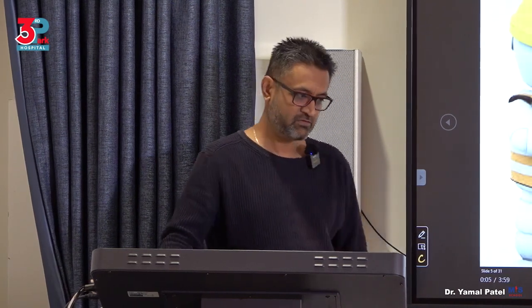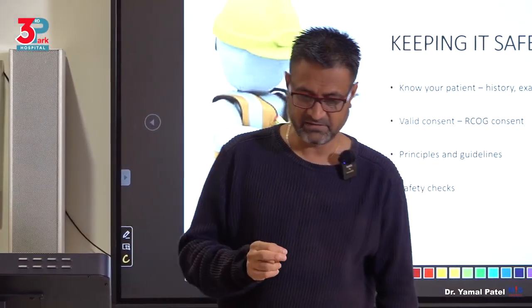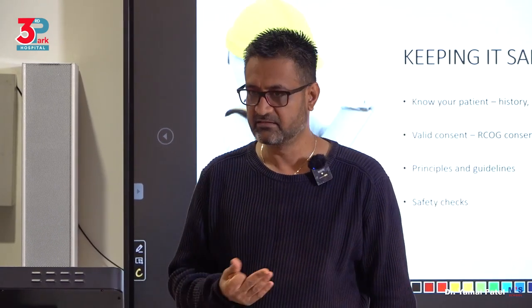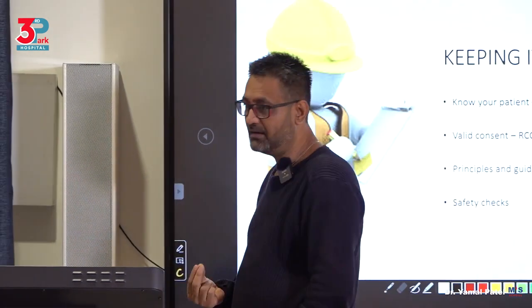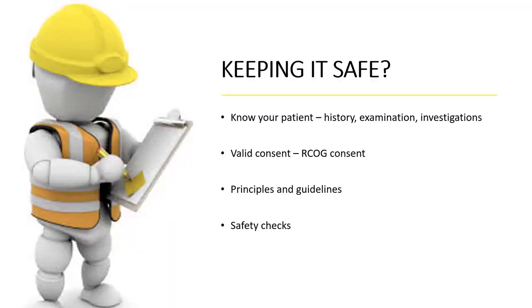I told you hysteroscopy might be a short procedure. Frankly, most hysteroscopies take me less than 10 minutes, okay? And most diagnostic hysteroscopies take me 2 minutes, okay? So it's a very short procedure, but I told you it can be very dangerous as well. So how do we keep it safe? We keep it safe by making sure we know our patient well, both in the history, examination, investigation, everything is clear. We keep it safe by having a valid consent.